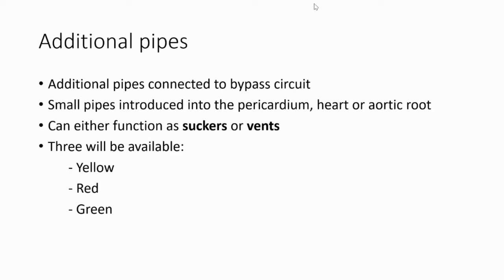Okay? So when we call something a sucker, or when we say we're using this as a sucker, what we mean is we are just haphazardly placing it in different parts of the operative field to suck blood as and when it accumulates in the pericardium.